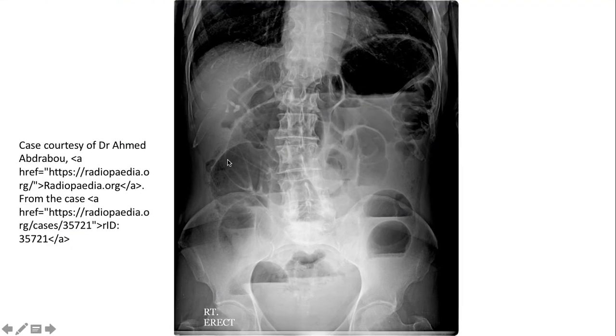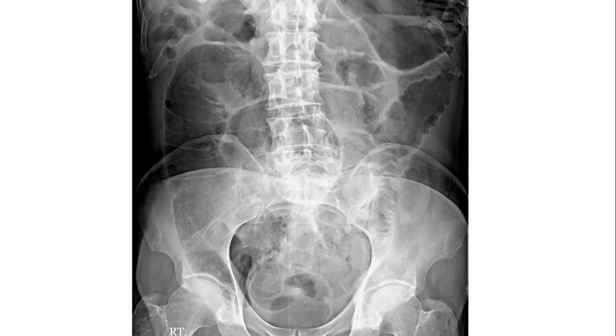So what is the acute abdominal series composed of? It's composed of three radiographs, two minimum, three. In some hospitals they use a protocol of three, which is a chest PA, an abdomen erect PA, and a supine abdomen AP. These are the three radiographs that must be included in the acute abdominal series to consider it a full study. So that's the first image. Now the second image.